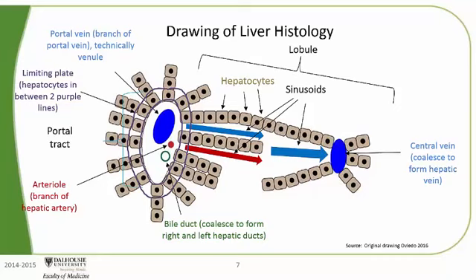Next, I want to show you how the bile is made by the hepatocytes and then enters the bile duct in this direction. The name of the tube that carries the bile in between the hepatocytes is bile canaliculus. People usually use the plural, which is canaliculi. The bile canaliculi compose a highly complex system of anastomosing channels. This drawing is a highly simplified version of a bile canaliculus.